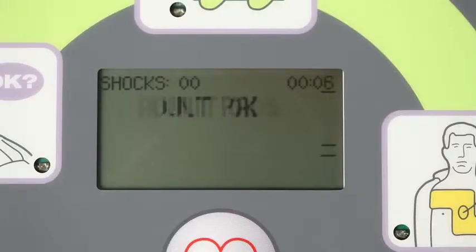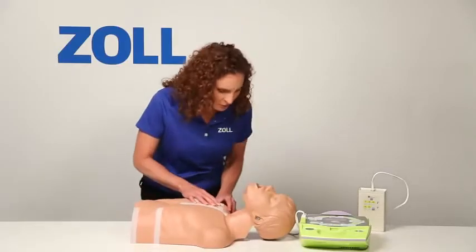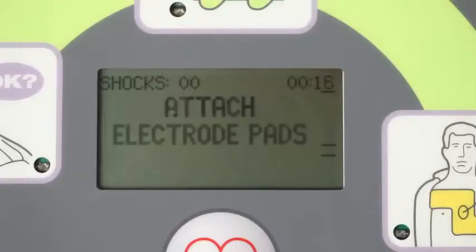Unit OK. Adult pads. Stay calm. Check responsiveness. Call for help. Are you okay? Are you okay? You, go call 911. Attach defib pads to patient's bare chest.